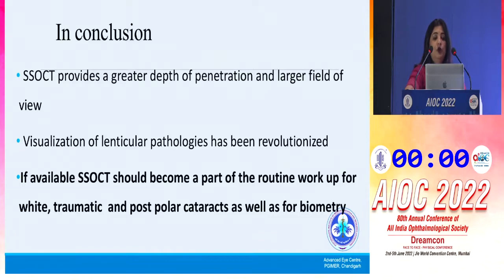So to conclude, SSOCT provides a greater depth of penetration and a larger field of view. The visualization of lenticular pathologies has greatly changed, and so has the management. And if available, SSOCT should become a part of the routine workup for white, traumatic, and posterior polar cataracts, as well as for biometry wherever possible.